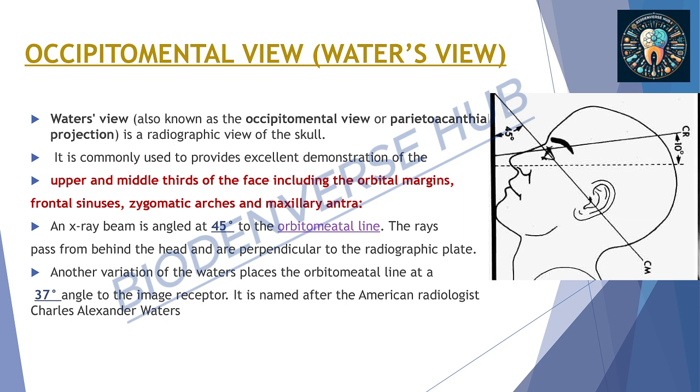It is a radiographic view of the skull. It is commonly used to provide excellent demonstration of the upper and middle third of the face, including your orbital margins, your frontal sinuses, the zygomatic arch, and the maxillary antrum. That is basically the maxillary sinus.